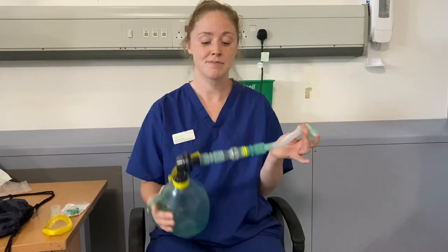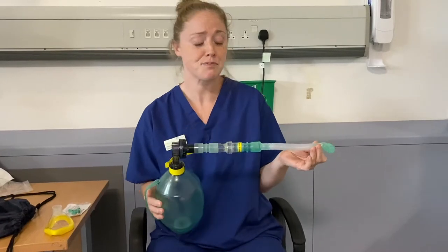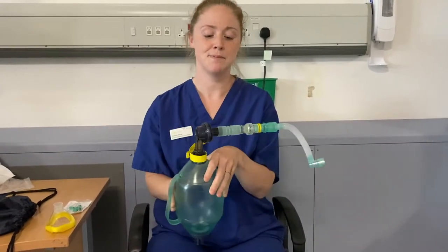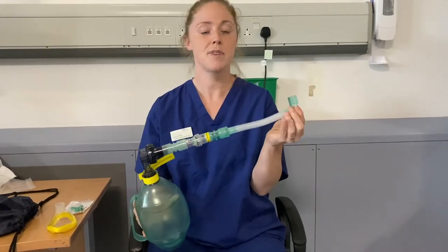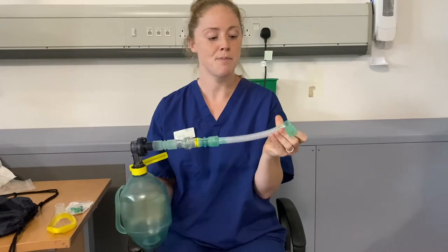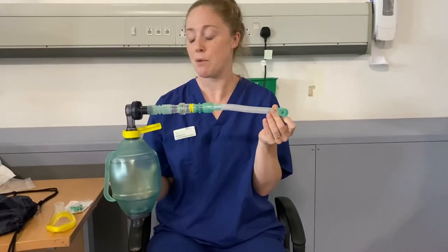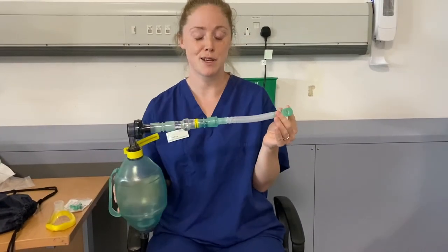The Lung Volume Recruitment Bag is a simple piece of equipment that may be chosen by your physiotherapist to help you improve your cough. It's composed of a squeezy green bag, a series of connectors, a one-way valve, and a long flexible tube. The bag can be used with either a face mask or a nose clip with a mouthpiece, depending on which is most comfortable and appropriate for you.